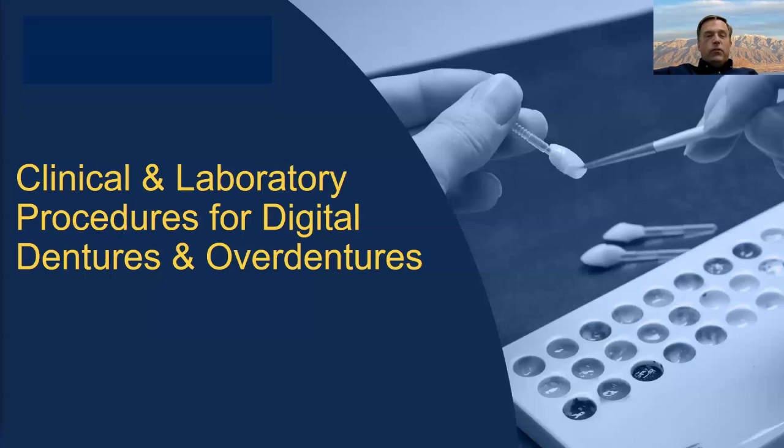I think what I was confused about is that digital dentures are supposed to be stored dry. So again, thank you for pushing me a little bit on that. I really appreciate it. Sorry for the wrong information before. So just to clarify, if you have an analog denture that's been processed in some way, either injection or heat processed or pour technique, that should be stored in water. And if you have a printed denture, it should be stored dry.